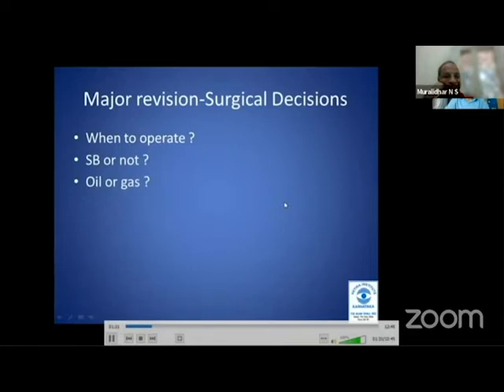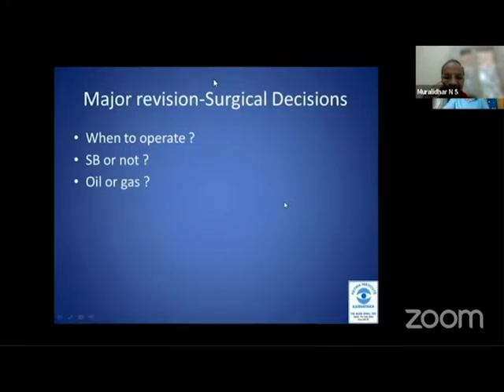What tamponading agent should we use? Because most often we have to do vitrectomy to repair a detached retina due to PVR. My rules are like this: if there is a scleral buckled eye that has got redetachment due to PVR, I will do a vitrectomy and I may use gas if it is a mild PVR. If it is a PVR following vitrectomy and gas, I'll definitely switch over to oil. And any PVR under oil always needs resurgery with oil. In some situations we may decide to do sub-silicone oil surgery.